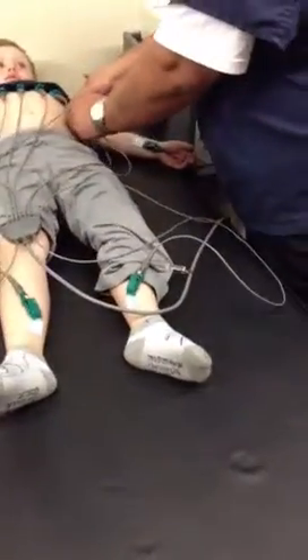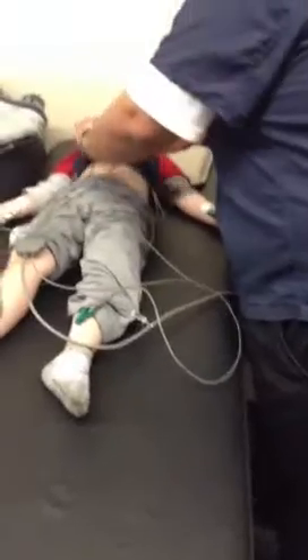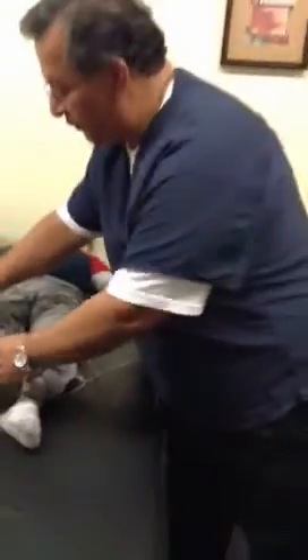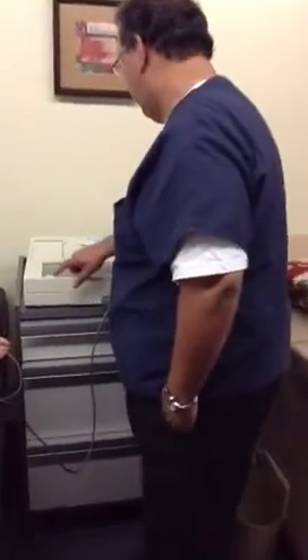Now while I'm doing this, I'm kind of watching the patient to make sure the patient's not uncomfortable or too cold. We need the patient to relax as much as possible. Now that all the lead wires are on, I'm going to go ahead and turn the machine on.